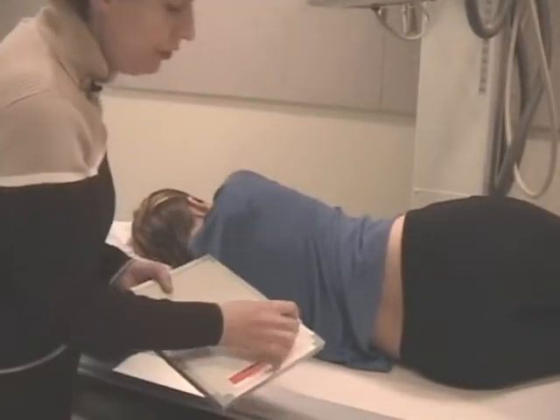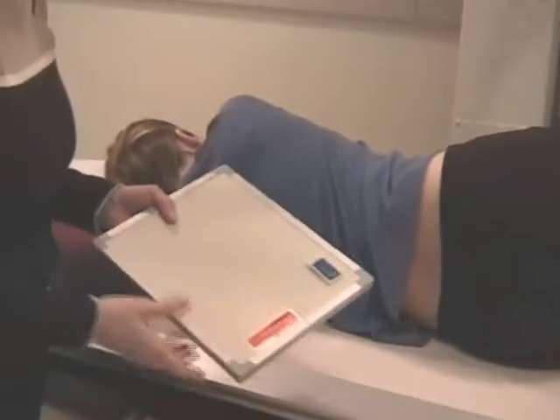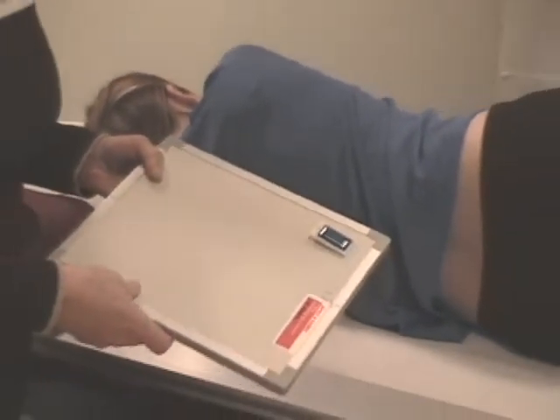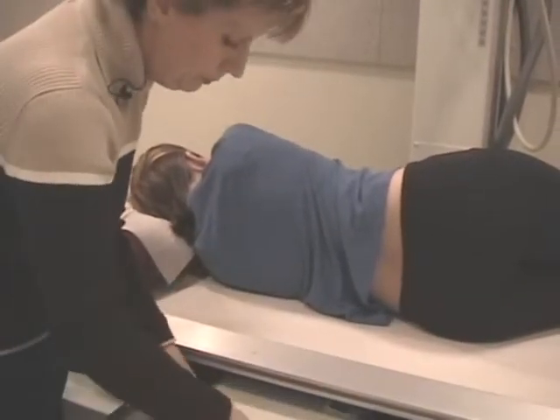I'm going to collimate to within the film's edge. I'm going to show about 1 inch of collimation all the way around, and I'm going to leave the ID blocker to the bottom. Therefore, it's consistent with the procedure, all the other films that we took, adding to the aesthetic quality of the image.